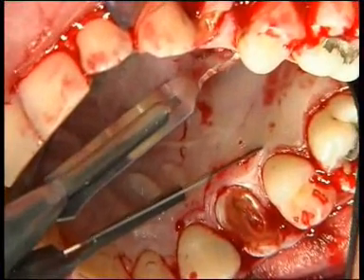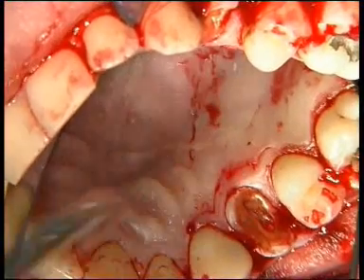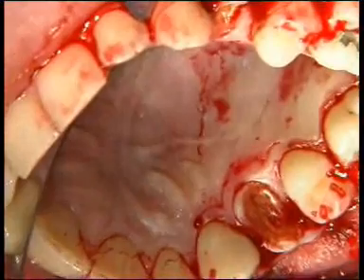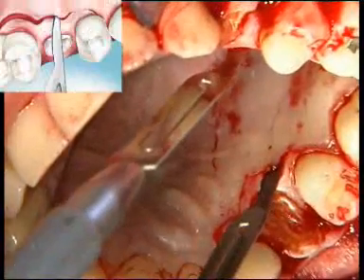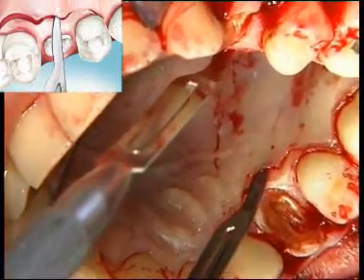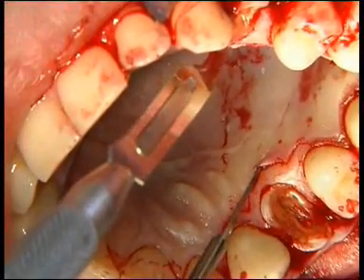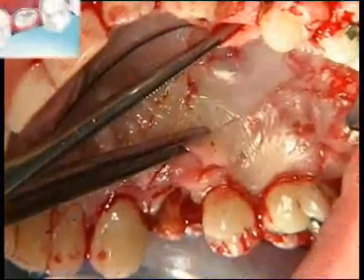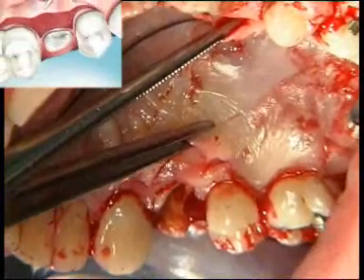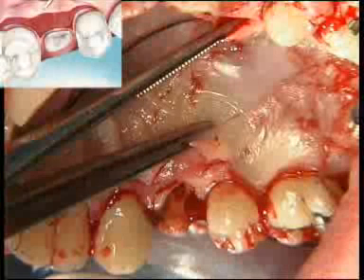A number of incisions are then carried out, positioning the scalpel blade parallel to the long axis of the tooth, with the aim of thinning the primary palatine flap. After reaching the desired apical extension, a full thickness incision is carried out on the most apical part, only now reaching the periodontal osseous structure.